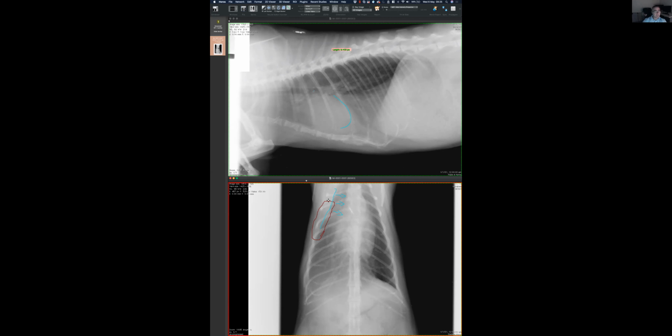Do you think everything is pleural? Do you think basically we are dealing with a pleural effusion? No. Why not? Well, unless we've got a pleural effusion and then a secondary sort of lung pathology as a result, I'm going to stand by my previous comment. Maybe the lateral is a poor choice for determining it, but I really just can't see vessels or anything like that in that area that I just highlighted.